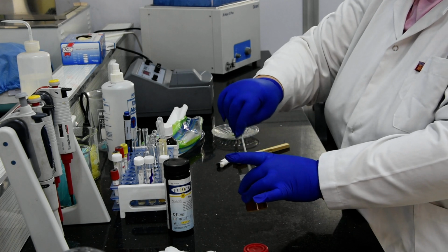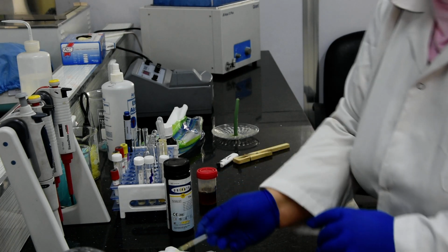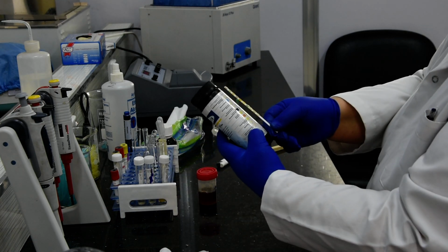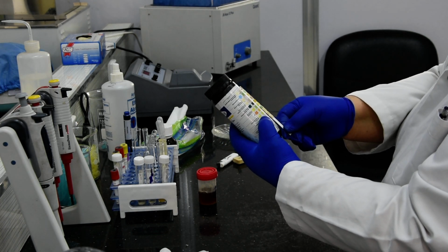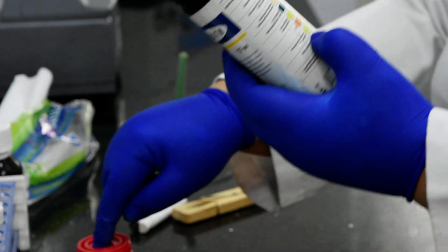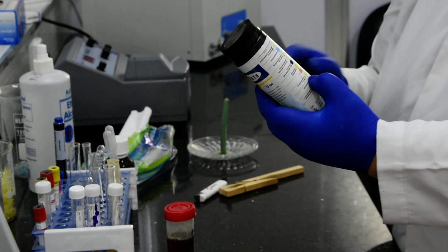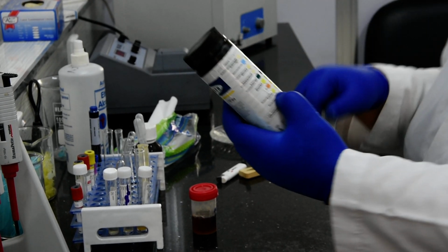And then compare with a chart. You see, this pad is sensitive to protein concentration. If we have a higher specific gravity of urine, it will cause interference, or if the urine is alkaline, it makes another interference in the result.